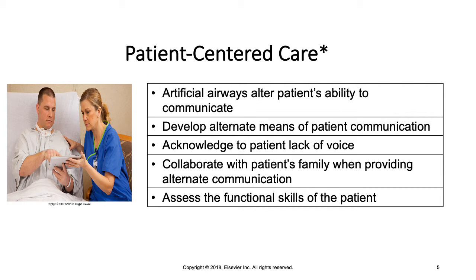Also, you want to ensure that you're speaking to the patient in their native language. So there may be a need to get an interpreter as well. So all things you want to be mindful of and look into in order to provide patient-centered care to your patients who may have artificial airways.